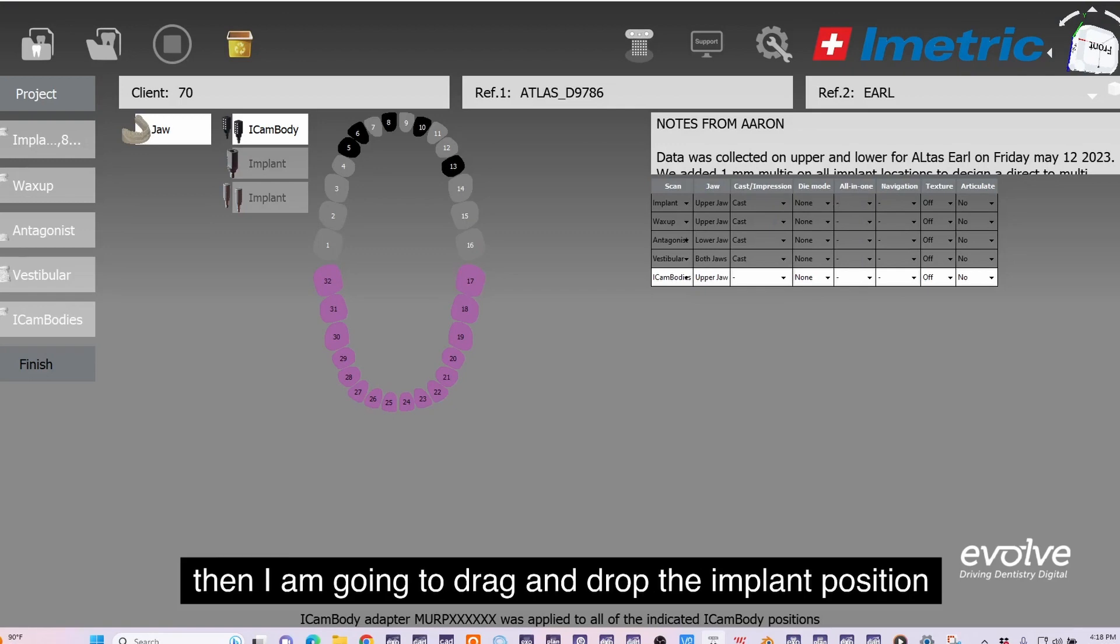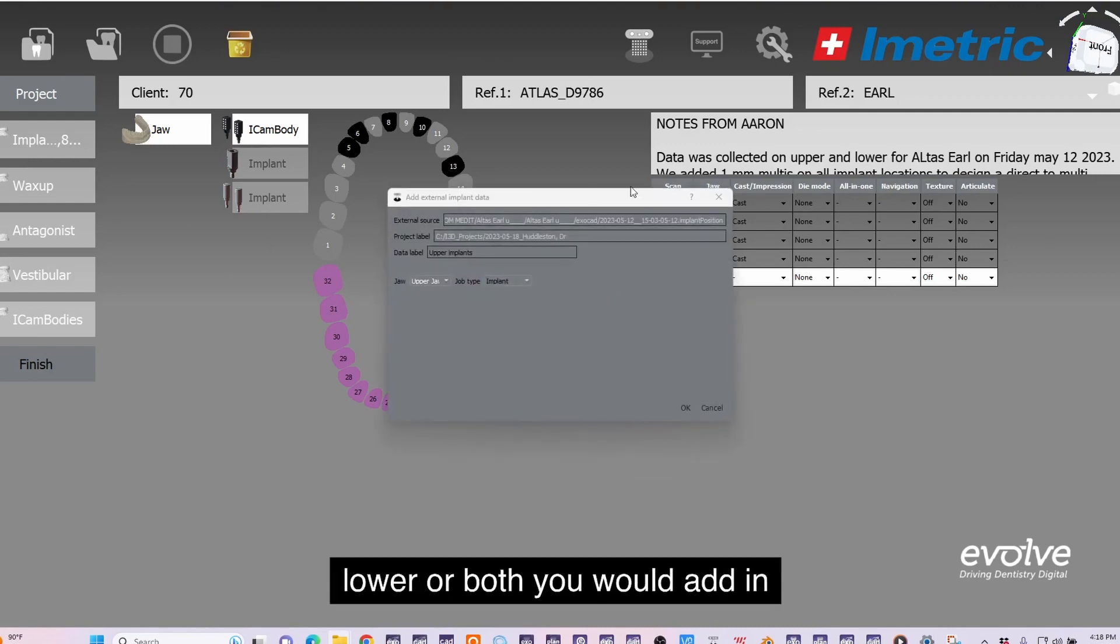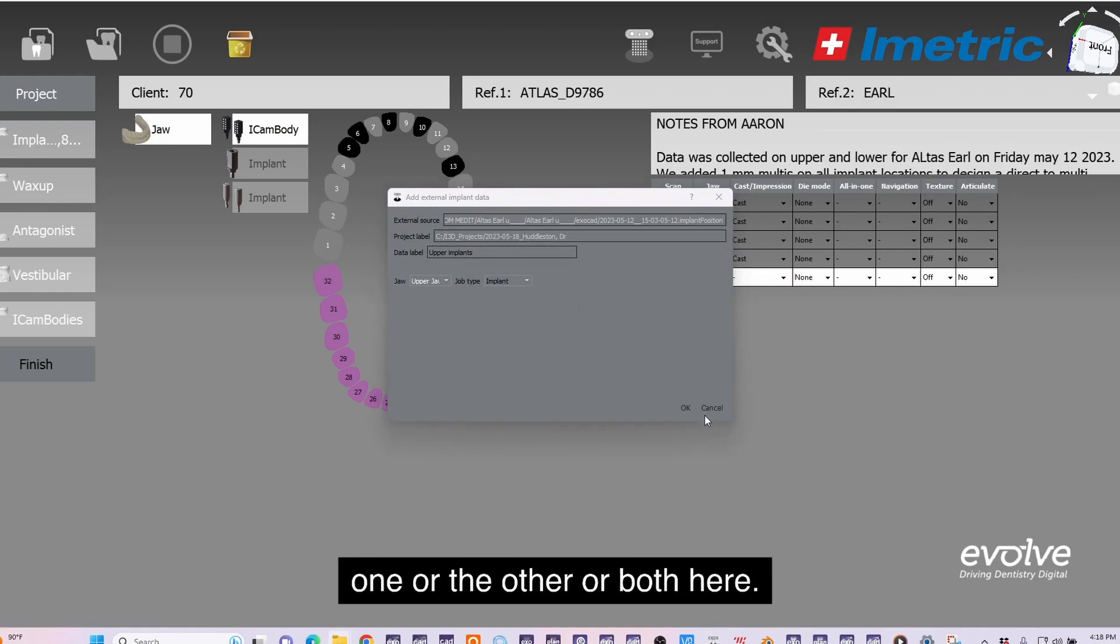Then we applied up. I am going to drag and drop the implant position files of the arch that I'm working on, the full upper or lower or both. You could add in one or the other or both here.